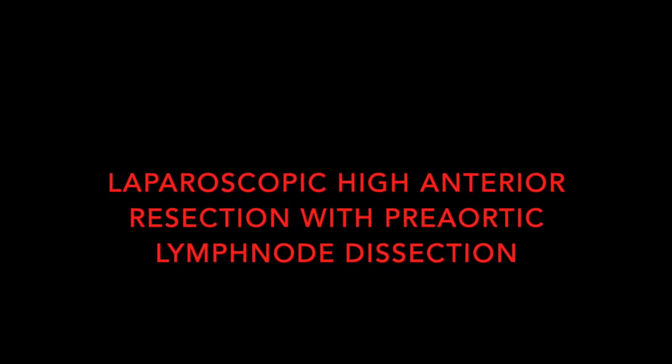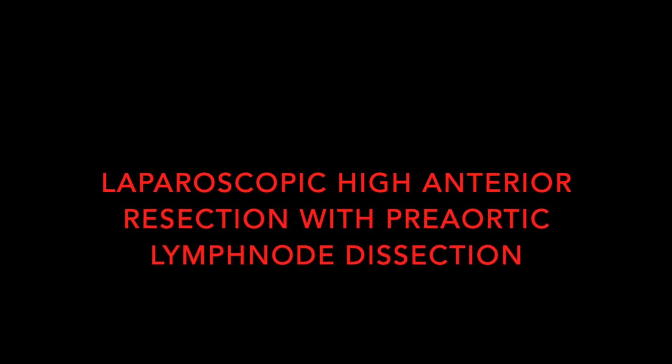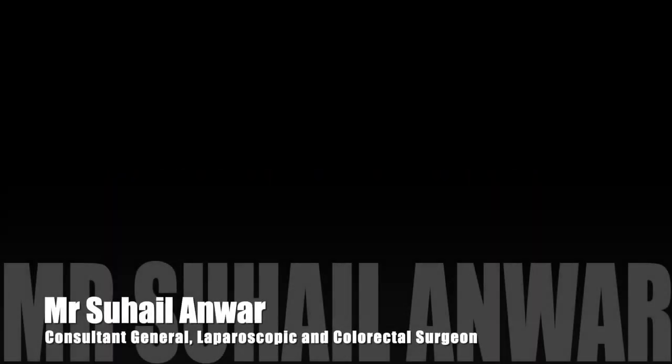Hi everyone. Our video today is a laparoscopic high anterior resection with particular emphasis on pre-aortic lymph node dissection and preservation of the superior hypogastric plexus.